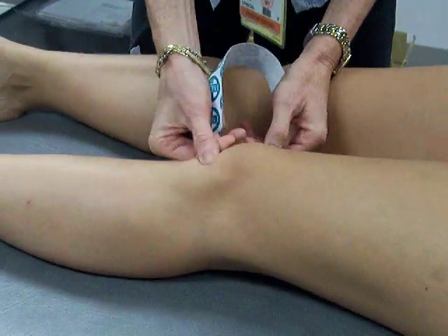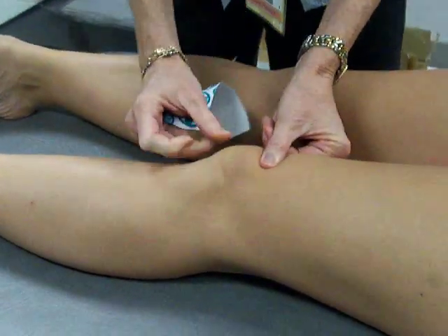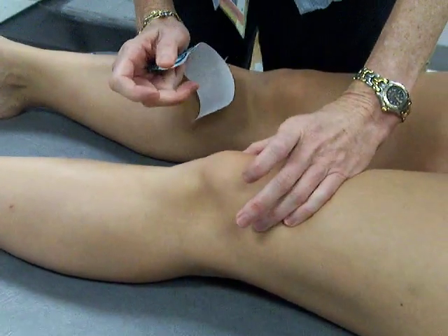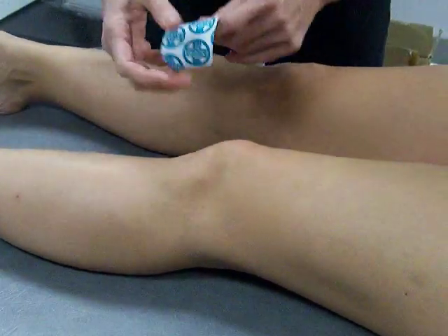A patella alta would be up kind of high. Usually they're lateral and you're wanting to tape them medially.